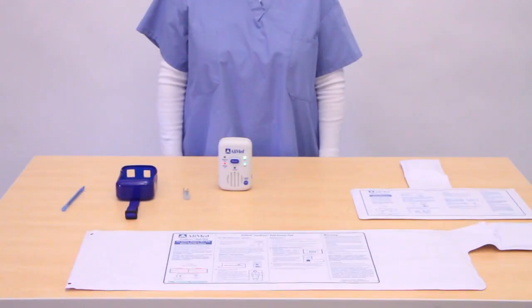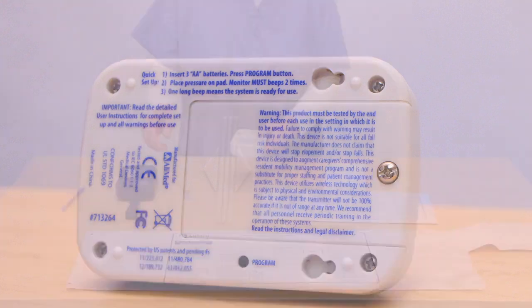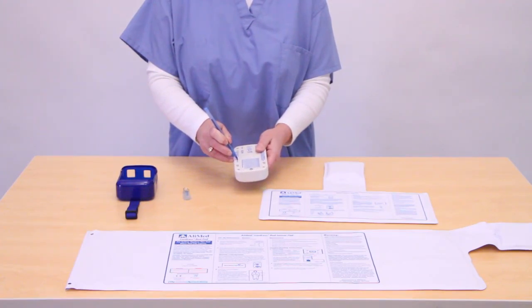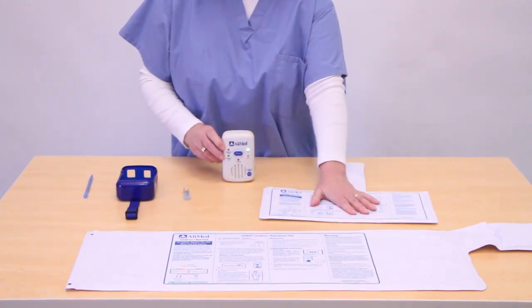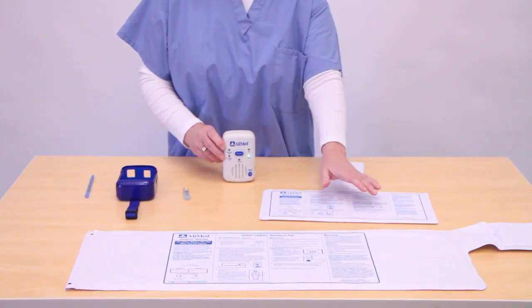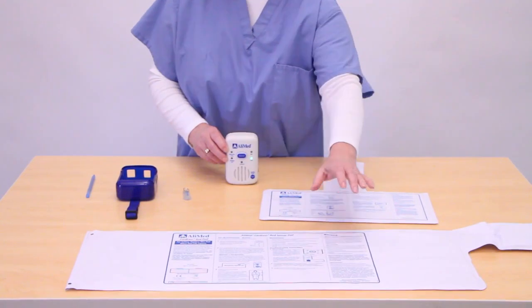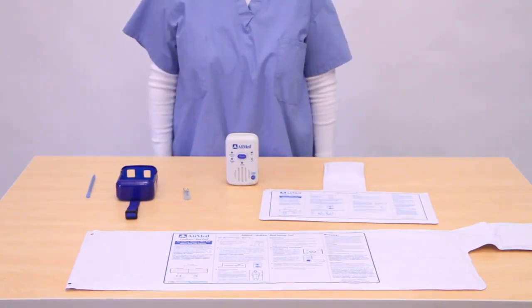Now the alarm is ready to use. Press and hold the program button on the back of the alarm until you hear three short beeps. To use with two sensor devices, apply pressure on the first pad to program it as pad one. The monitor will beep twice. Continue to program the second pad by applying pressure. Press the reset button to complete programming.